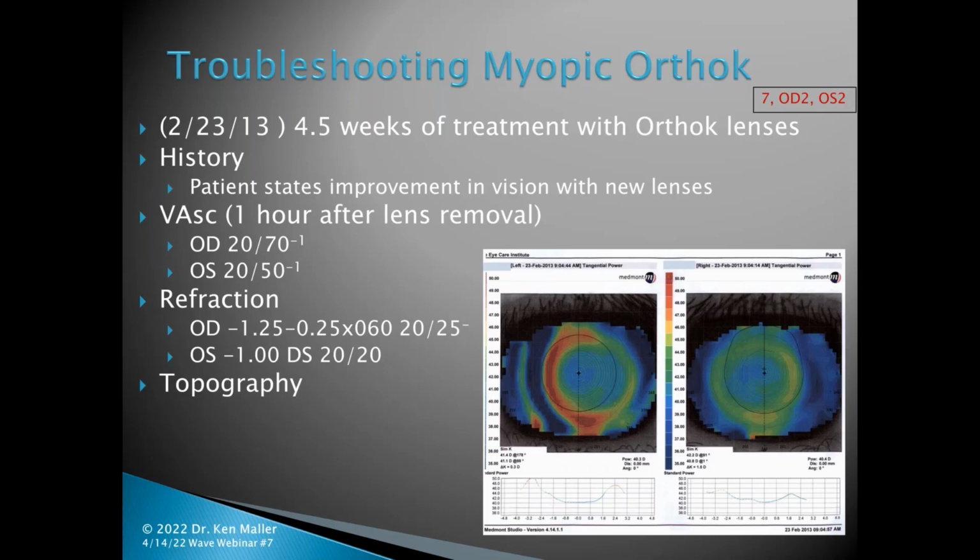We can definitely see that the right eye is undertreated. And the left eye is not looking very good. It looks like it's almost something of a double ring there that's starting to form. It's a little bit tight on the nasal side over there. And so this does not look like an improvement to me over the first treatment topographies from that first pair of lenses.